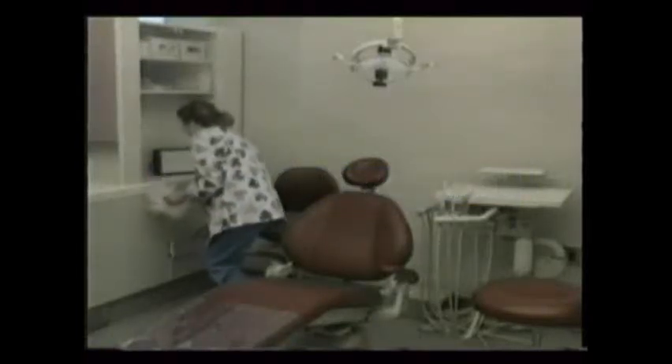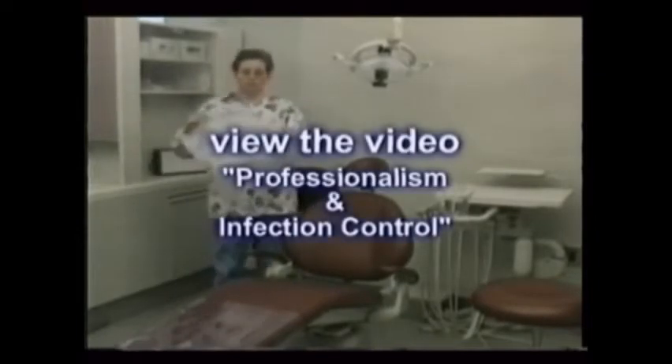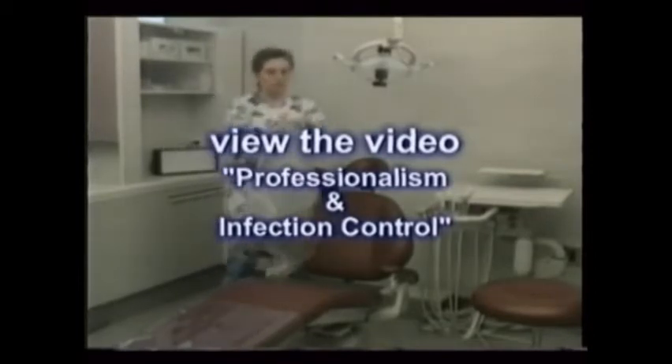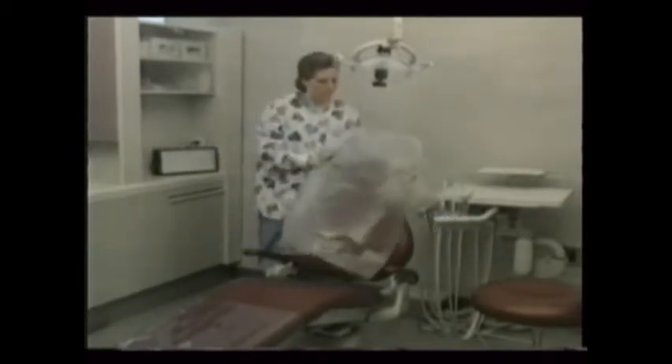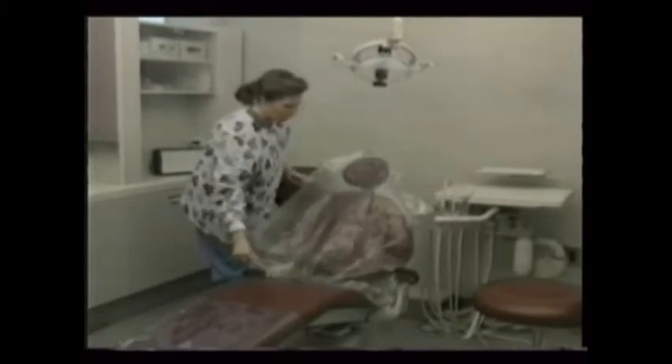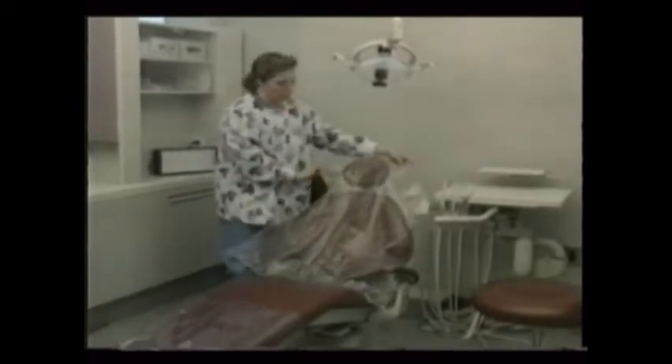Before demonstrating the different x-ray techniques, we need to spend a few minutes discussing asepsis. If you've not watched the infection control portion of the films, review it before moving to direct patient care and x-ray. The dental x-ray room is usually also the treatment area, so the infection control procedures are the same as those used in routine care.